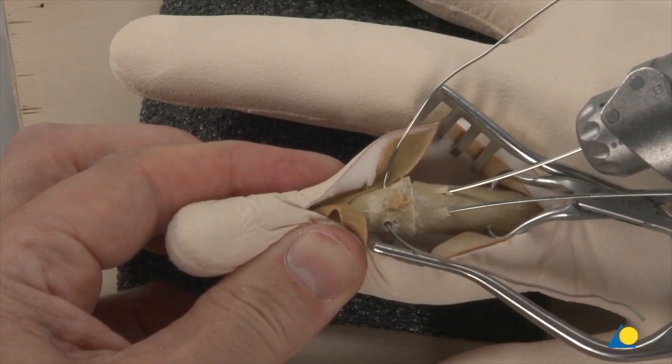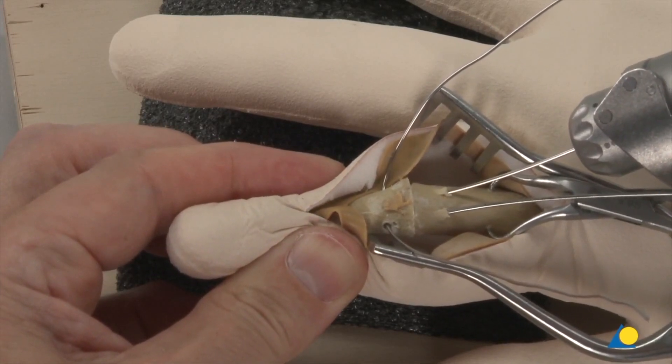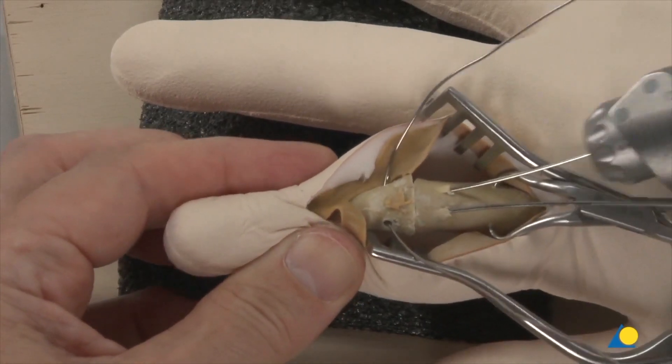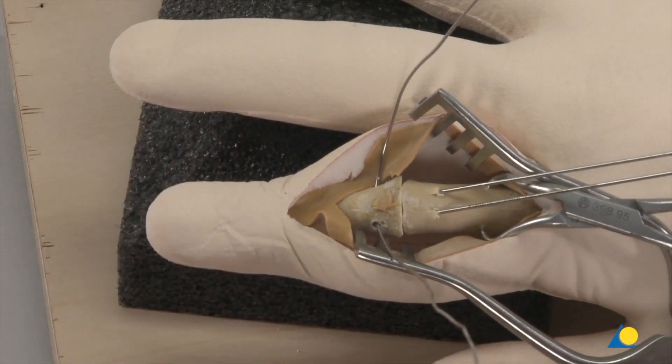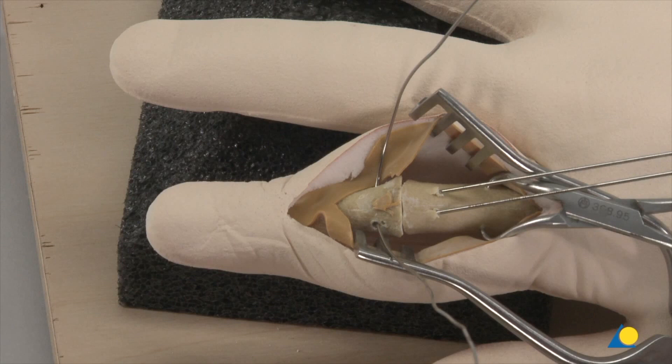Starting about 1 centimeter proximal to the osteotomy, two 1.0 millimeter K-wires are inserted parallel from the dorsal cortex of the proximal phalanx into the palmar cortex of the middle phalanx. The sharp trocar tips should not interfere with flexor tendon gliding, so it is important to check the correct position under fluoroscopy and eventually pull back the K-wires slightly.